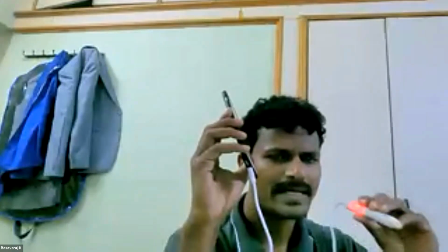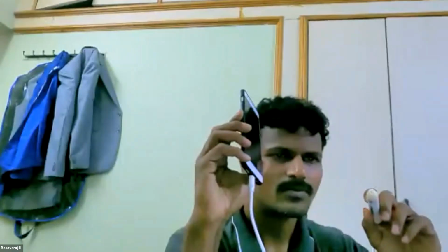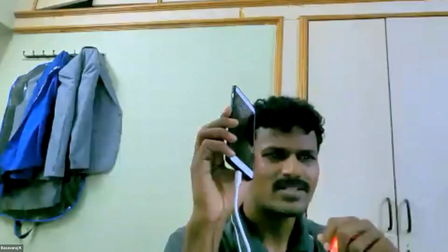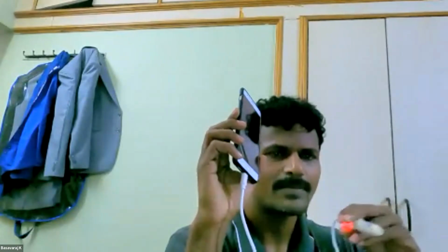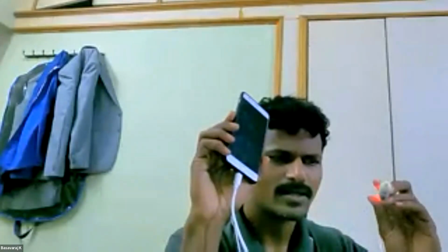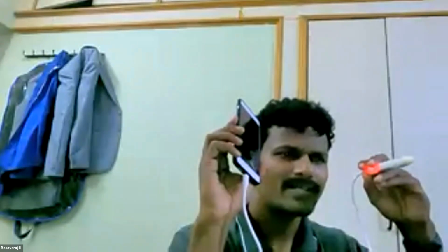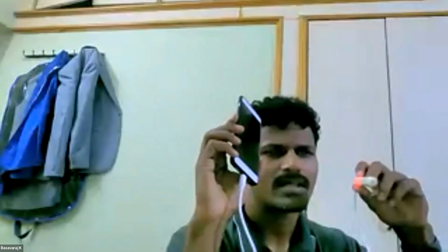The moment you put the sensor on the radial artery, you can observe the patterns on the mobile. If the patterns are not coming out good, you can retake the pulse by varying the pressure. Once it has taken the 20 seconds report, you can scroll back and check if all the patterns are good. Then you can go for the report generation. From there, you can download the reports. I'll just show you a few things.